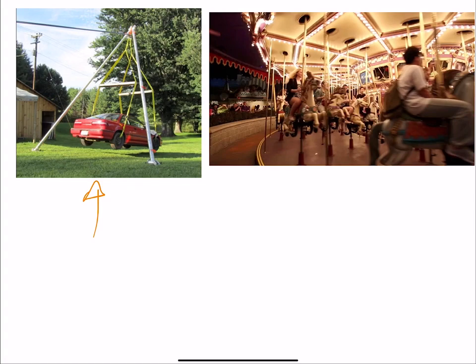Yeah, right, because you can't pull too hard, right? So in that case, it's more like your example of a long, slow force, but you're moving around with it. And that's essentially what the B1 field has to do. The spins want to precess, right? So I can maybe tip it a little bit, but I have to keep going around with it to get it to tip all the way. Okay? So you can think of that merry-go-round as a little bit what we're going to do.